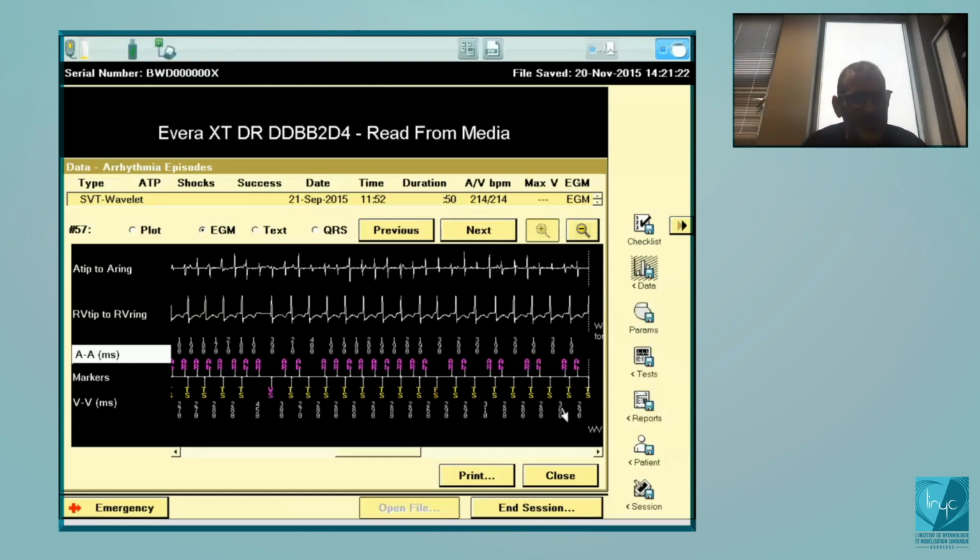Okay, so at this time the device will say, okay, this is compatible with a stable rhythm, and therefore diagnosis can be conducted atrial flutter. This is not atrial fibrillation, in fact. And that's a wrong diagnosis, but that's the diagnosis of the device. This is not atrial fibrillation. That can be a conducted atrial flutter or a dual tachycardia.